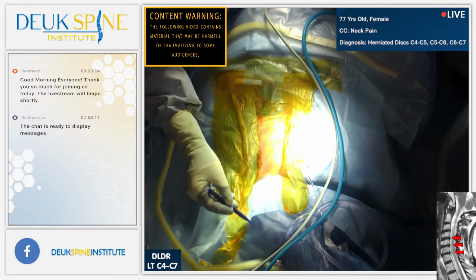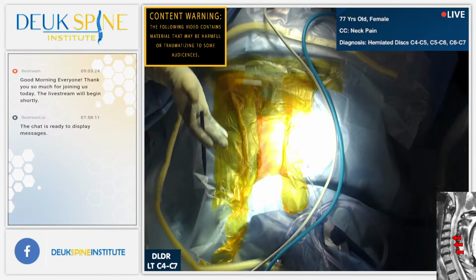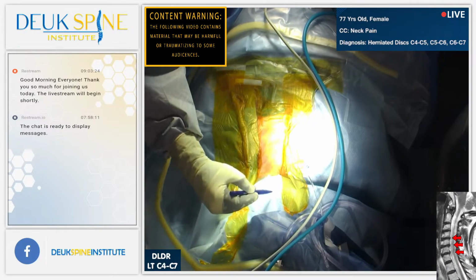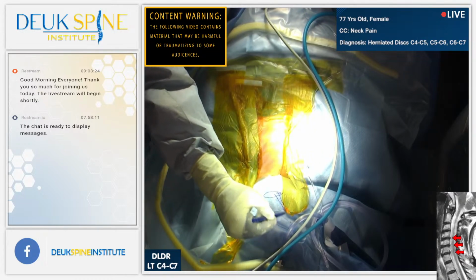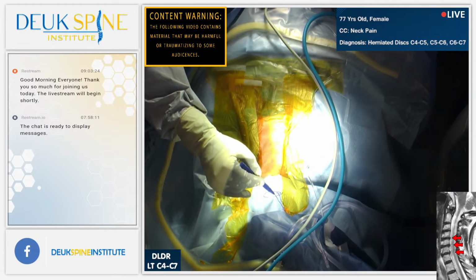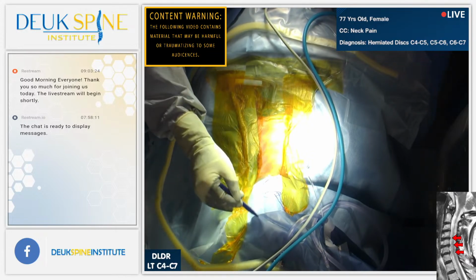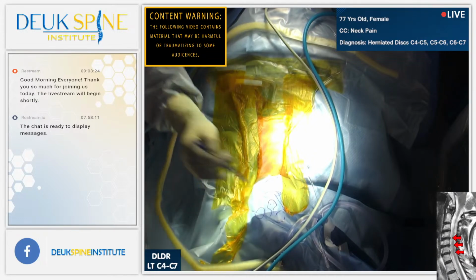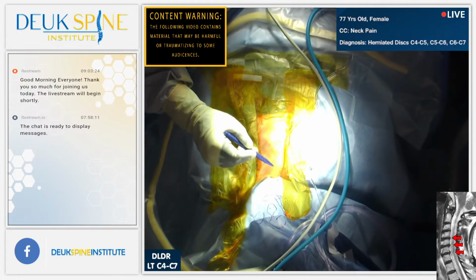Yes, we can. So we're going to start by showing you, this is a patient who's sterilely prepped and draped. This is real spine surgery. The patient's intubated. They have a tube coming out of their mouth. The mouth is here. There's a tube literally coming out of the mouth, going to a ventilator over here, and that tube goes down into their trachea. Their chin, the patient's chin is here, the eyes are here, the nose is here, and believe me, she's a lot better looking than that, but my artistic skills are not great.